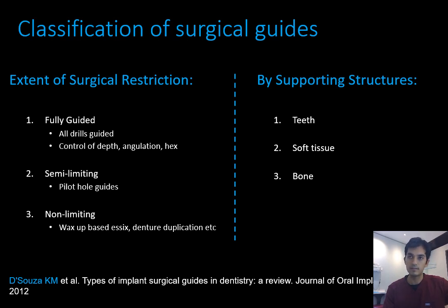And what I mean by that is how much does your guide limit the movement of the drills through that guide. You can have cases done fully guided, which is what I'm going to show you with this particular case using the R2 gate surgical kit. In a fully guided case, all your drills, every single drill from your initial drill to the final drill, and sometimes even the implant placement itself, go through the guide. The guide limits any movement of your drill other than what it allows, so it keeps you true to what the guide allows.